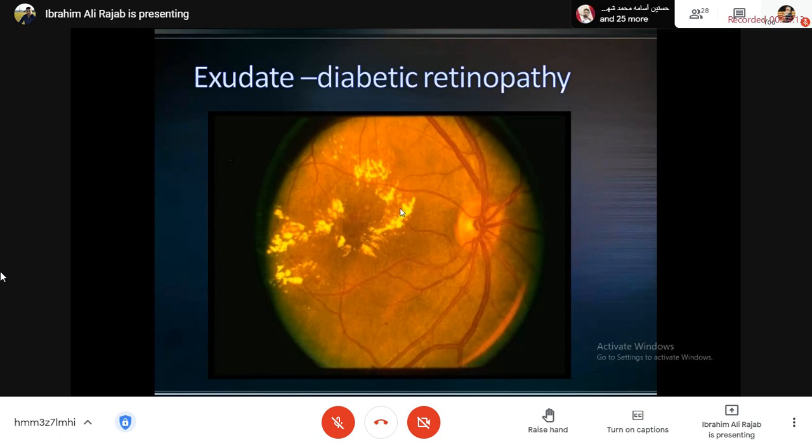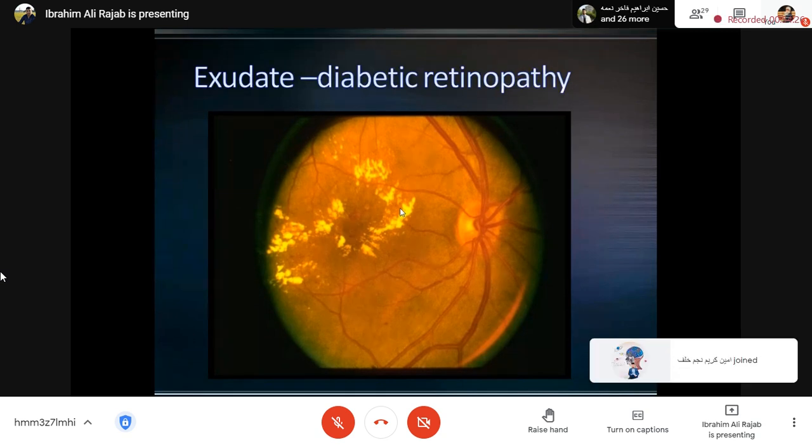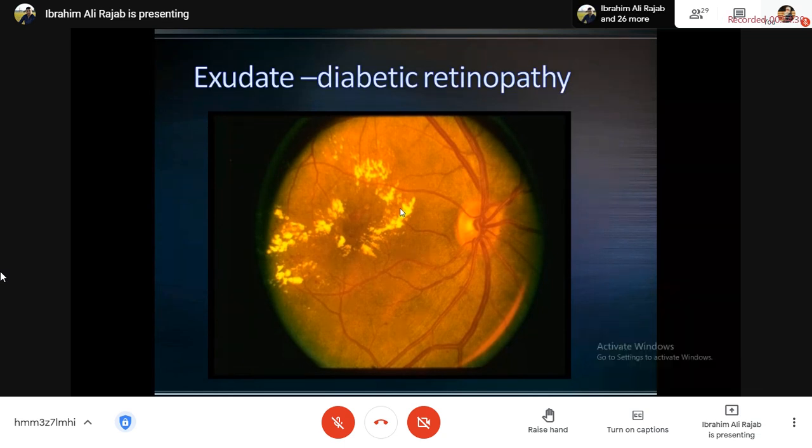عافية. إيش قد تقريبا تنطين هذا الكاب تو ديسك ريشيو اللي يسموها سي دي ريشيو؟ كلامك مضبوط. 20%. يس، تقريبا 20%، كلش صغيرة. فأنت اعطيتيها 20، وكلامك كلش مضبوط. شكرا لك. يلا نشوف أمنية رافد.